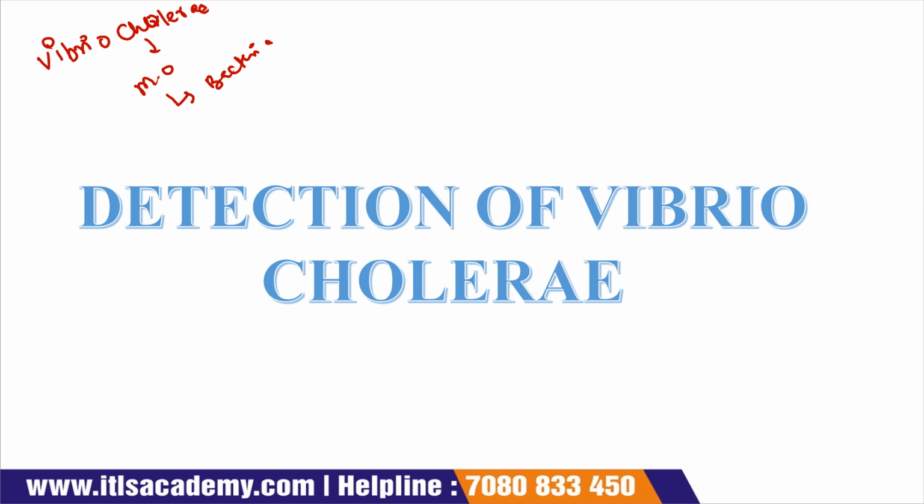And which type of bacteria? It is gram negative bacteria, comma shaped, and facultative anaerobes.